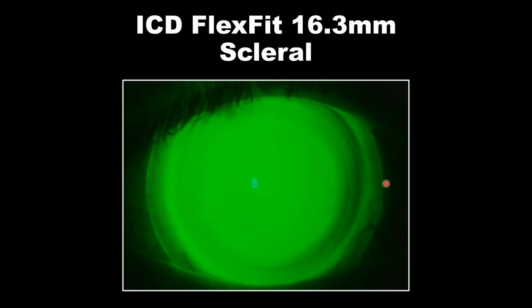Now, what it does require, of course, is our ability to image the vast majority of the cornea. So if you've got a corneal transplant patient and the rings are just completely distorting toward the periphery, then that's going to limit your ability to accurately estimate the height of that anterior chamber. But for most eyes that we're able to reflect the rings to the peripheral cornea, we should get a pretty accurate interpretation. At least that's what the studies have borne out.